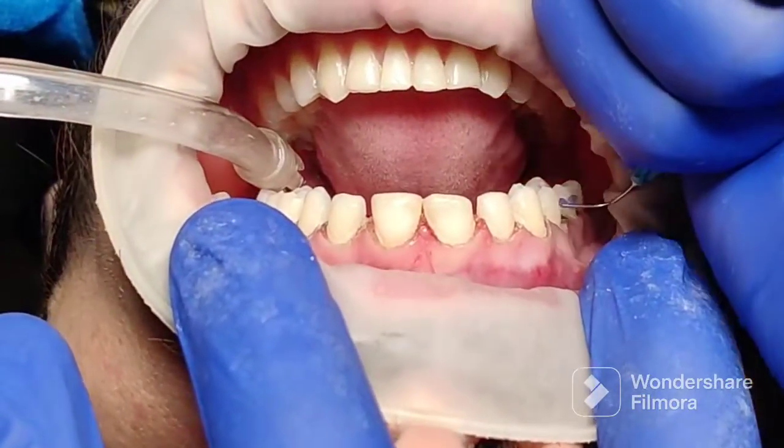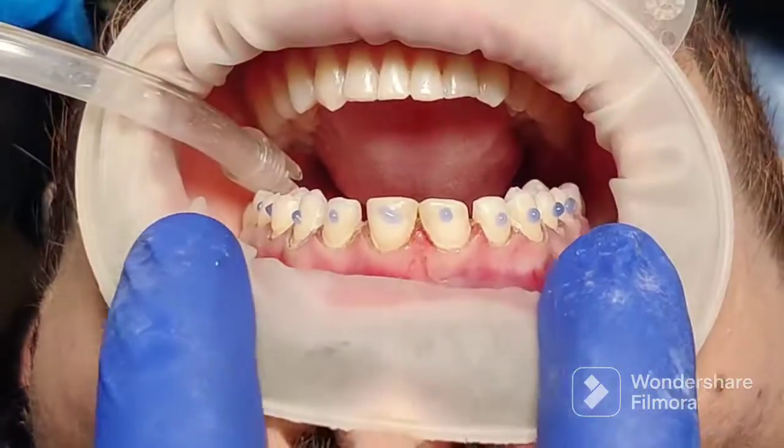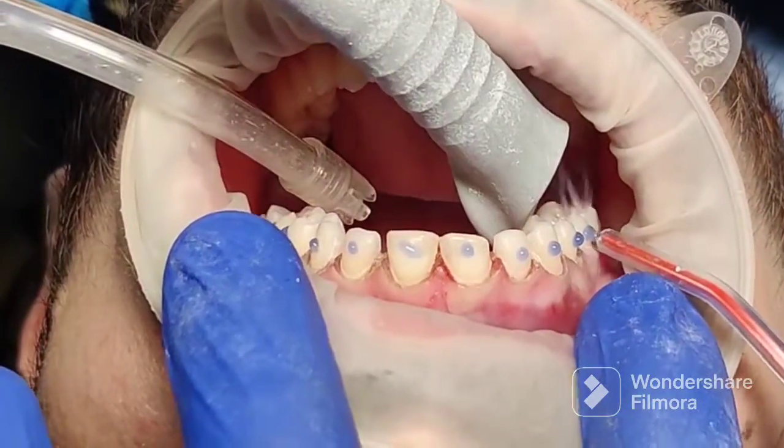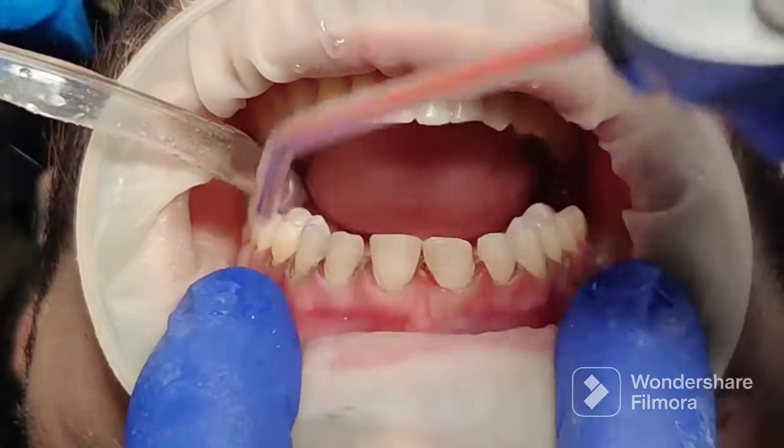Welcome to another video. I'm going to show you how to make temporary veneers at the end of the appointment, when you have completed the tooth preparation and the scan or impression. The first step is to etch the tooth.